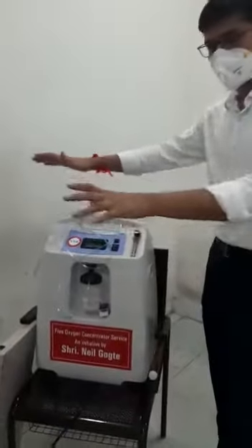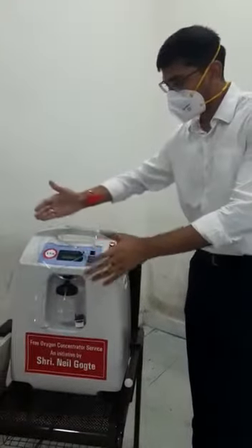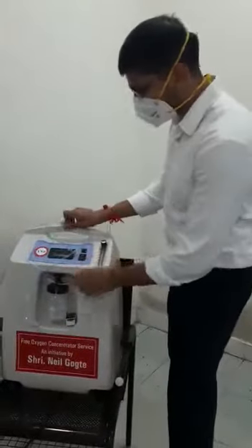This is a concentrator. Place it in a well-aerated area, like beside a window, and place it at least one to two feet away from the wall, so it has air to breathe. Then switch it on.